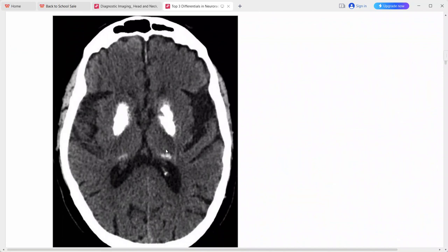This is an adult man presenting with muscle pains. Axial CT scan shows bilateral symmetric calcifications involving the lentiform nuclei and posterior thalami. Basal ganglia calcifications in an adult — the top diagnosis is any endocrine disease process like hyperparathyroidism. Differentials also include senescent calcifications related to normal aging.